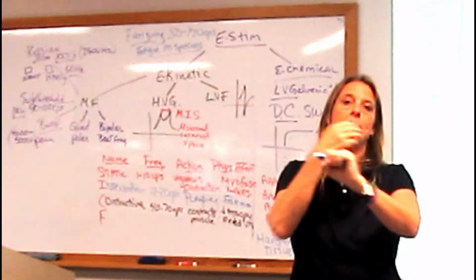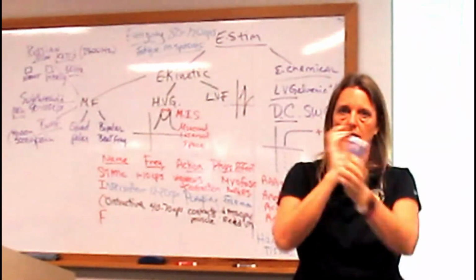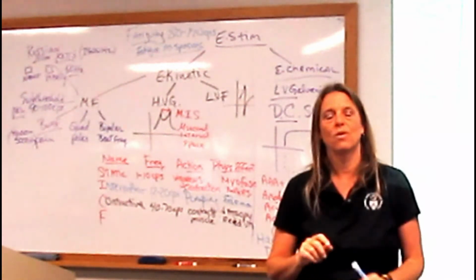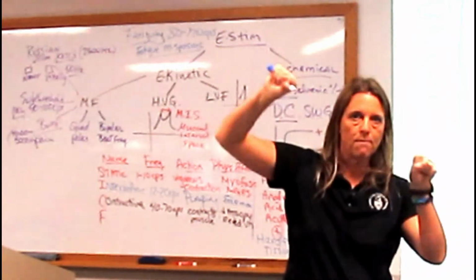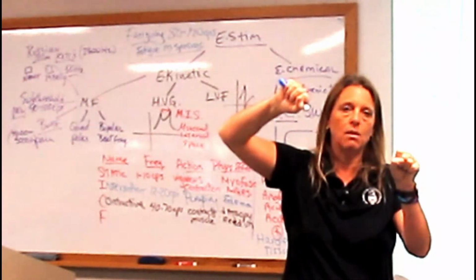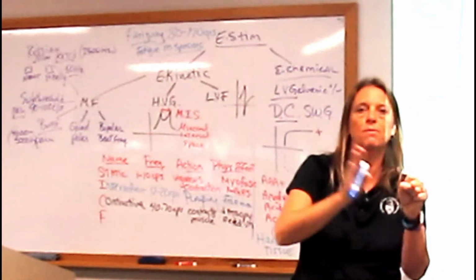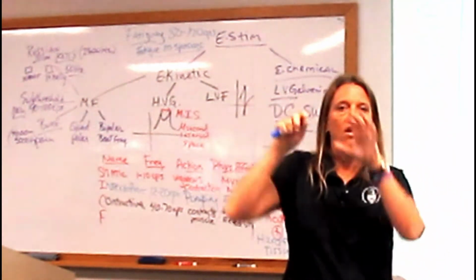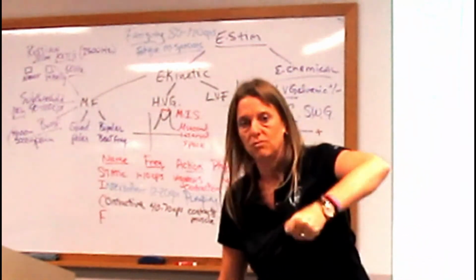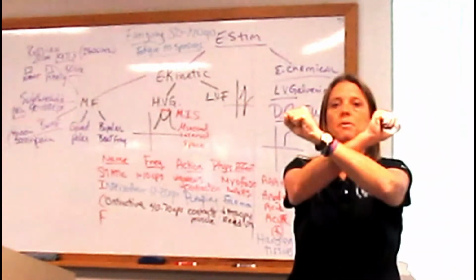And a vector makes the patient feel like this, like the stimulus is going all over the place. But really, it's not at all moving the pads. What it is, it's going to cause channel number 1 to go from a certain set intensity, you'll set it in the beginning, and then dip down to either 0 or maybe 60%, and then the other channel is going to do the same thing. So here's how I describe it to my students, and you guys have seen me say this. It's going to be channel number 1, channel number 2.